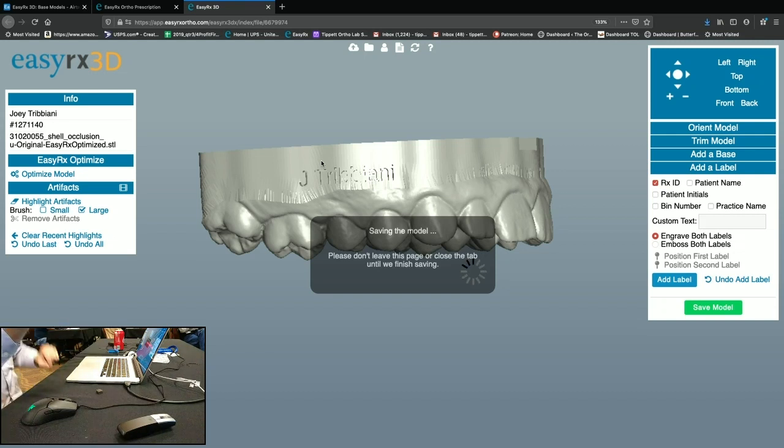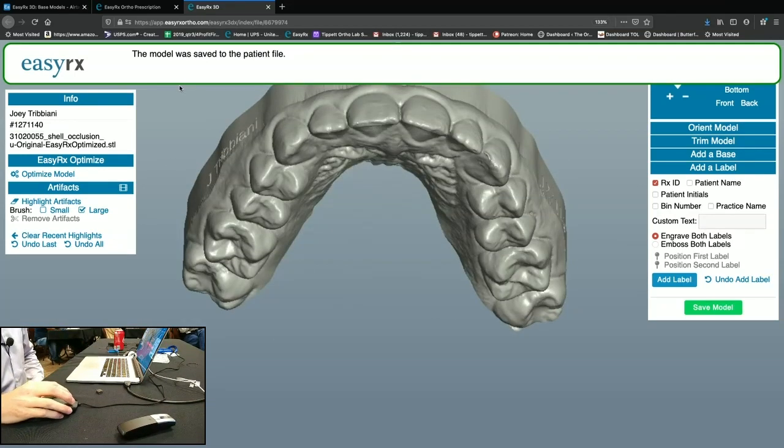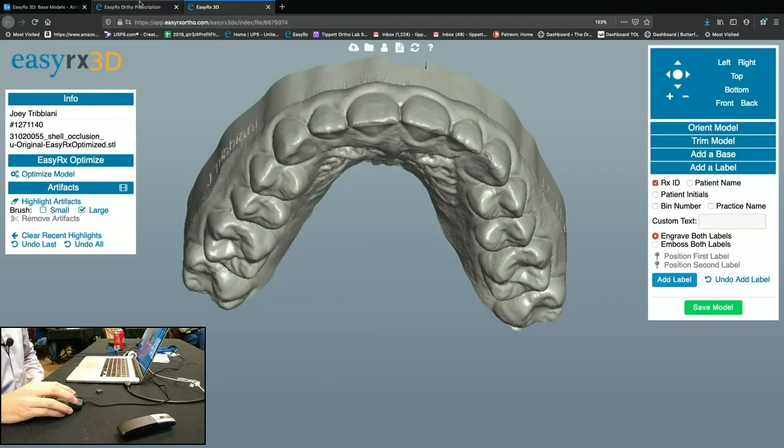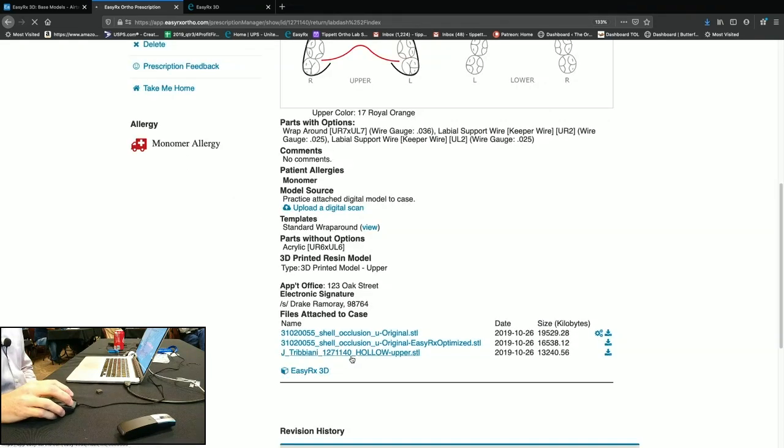You can't mess up the original model. It's like a master cast that lives forever. That's one of the great things about this. So if you go back to your script and click the refresh button, you'll see it now pops up.